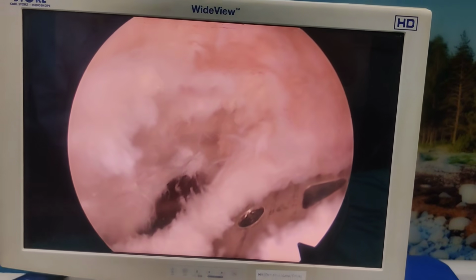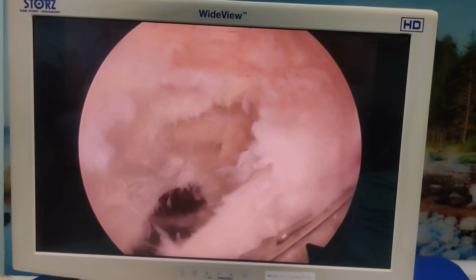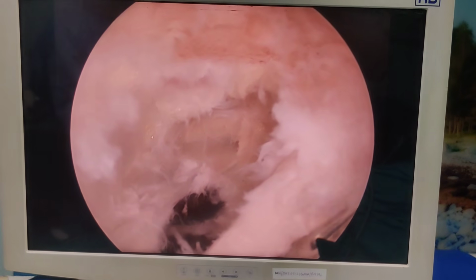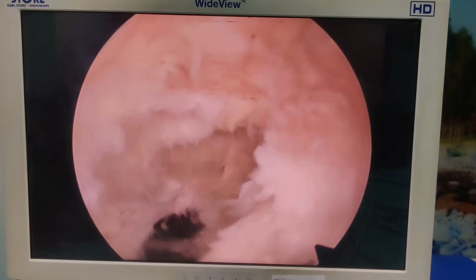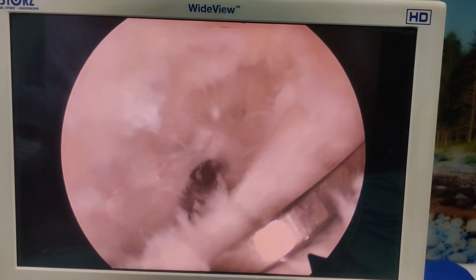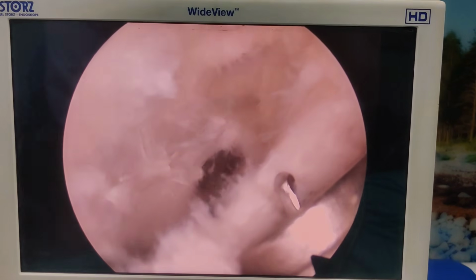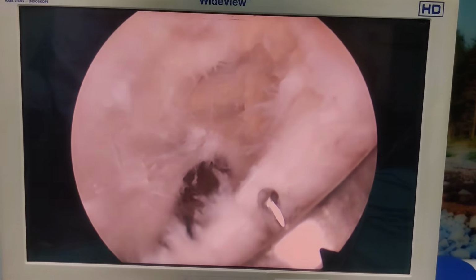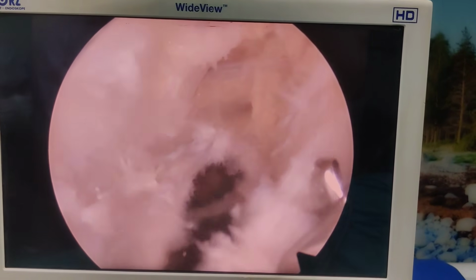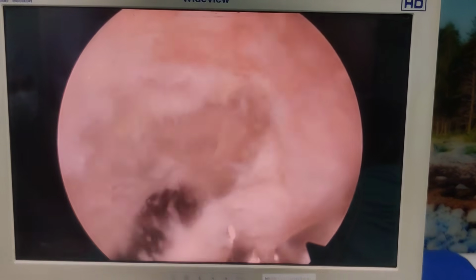And now since it is down, the next step will only be to pass our drill bit. We are just going to drill it, and while drilling, this is a closed system, but still I am going to ensure that I am keeping something like a curette in the back so that there is no chance of the drill going in the back and doing any harm. Now we are drilling under direct vision, so just continue to drill please and go slow. That's it. Now we can see that this has come out and it is under direct vision. But if you want, you can keep something like a curette in the back just to prevent it going any further. Once we have drilled it, I'm going to take some C-arm images to see if it is in the right place, and once it is in the right place, then we will do our tibial tunnel.